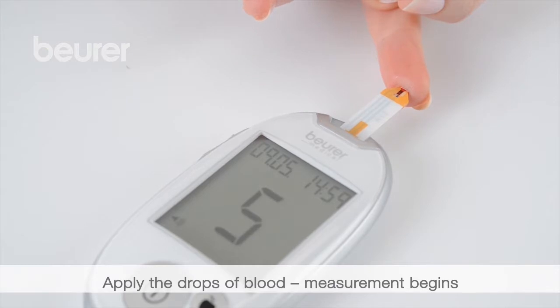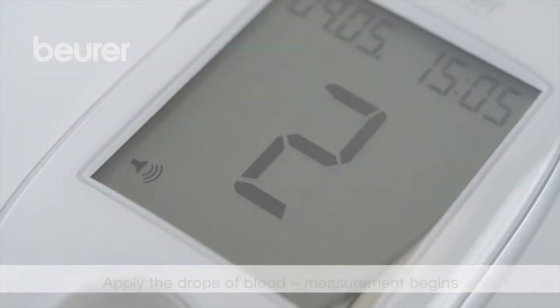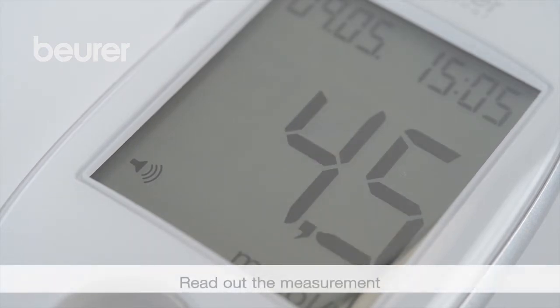Completely fill the input gap with the drops of blood. The device begins counting down. The measurement can be read out and labelled — you cannot label it later.